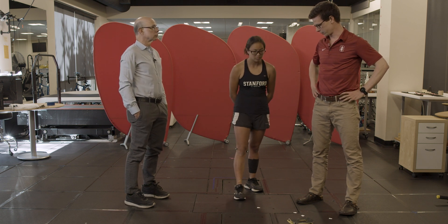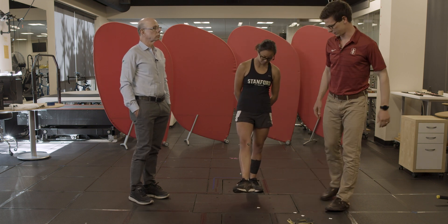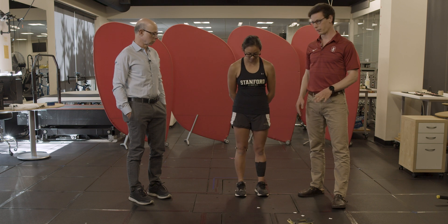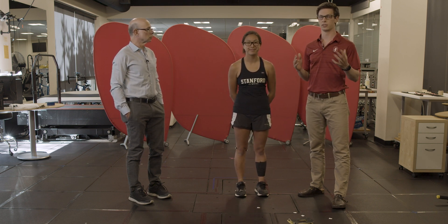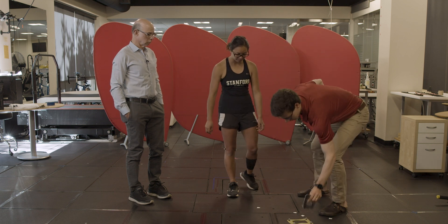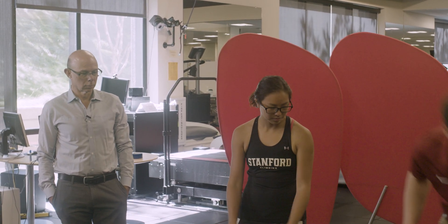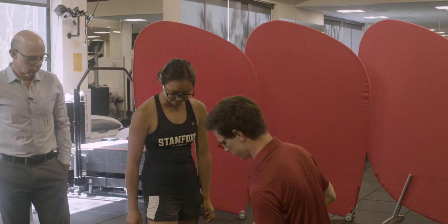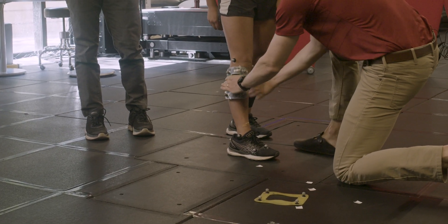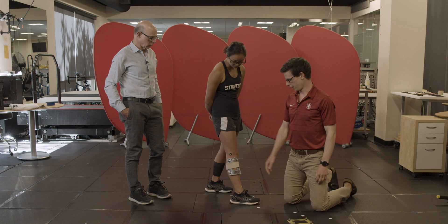We also want a tracking reference frame. The reason is that we'll take off the medial markers during experiments so Hannah doesn't rub them off while walking and running, and also because when her legs pass by one another, the markers get occluded from the cameras. You want the maximum number of cameras to see a marker at any given time to get an accurate 3D location. For the shank, we put on this tracking frame — it doesn't matter where it is on the limb, we just want it to not move throughout the experiment. It has three markers so we can establish a tracking reference frame, and these are orthogonal, making it a good set of markers.